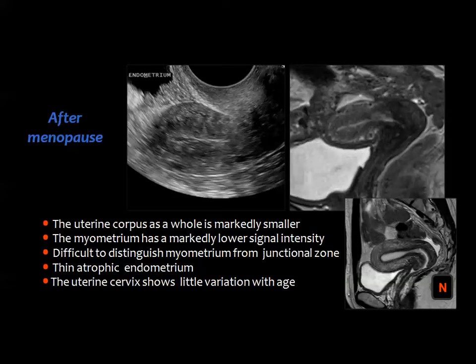After menopause, the uterus becomes smaller and the myometrium has a lower signal compared to the reproductive period. The postmenopausal uterus shows relatively darker myometrium, the junctional zone is not well defined, and the endometrial cavity is small or atrophic. The cervix, however, may maintain its normal size and is not liable for the same changes.